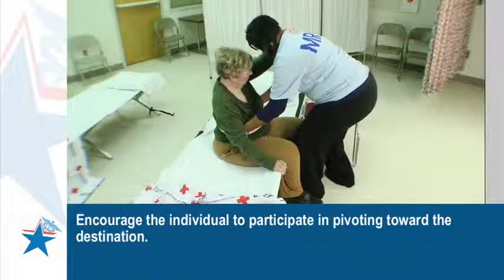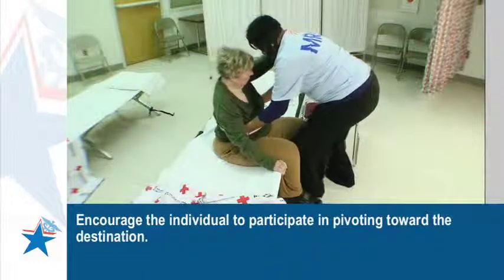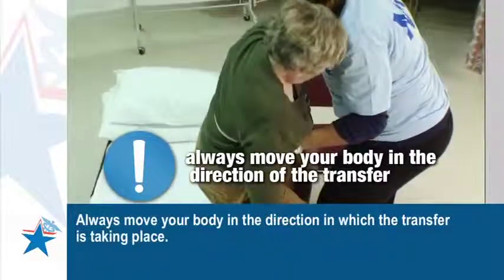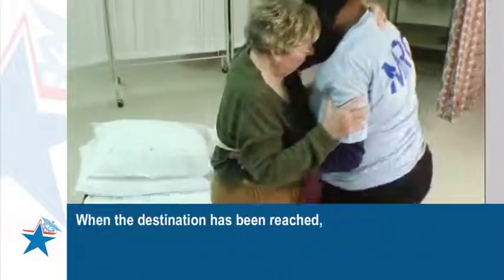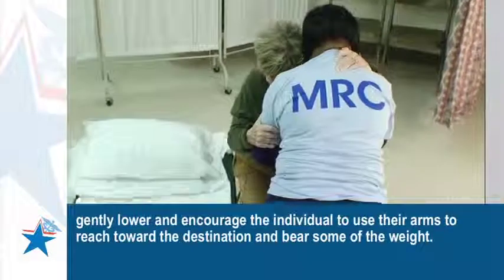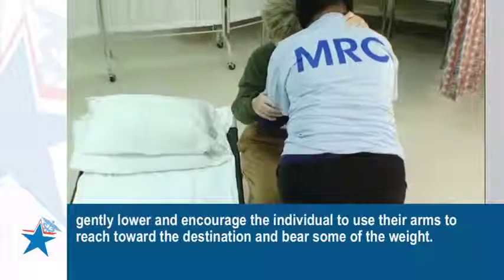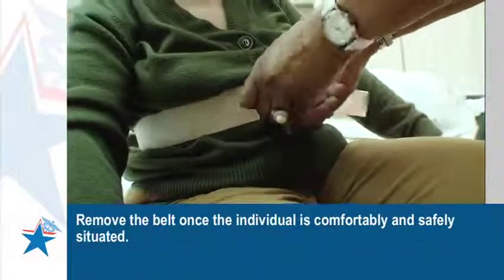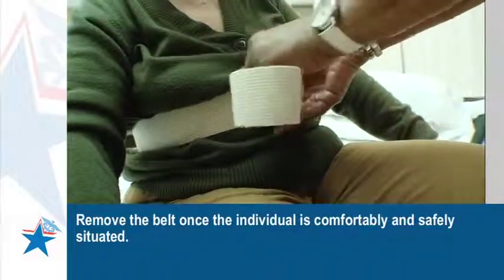Make sure the individual can see the surface to which they are transferring. Encourage the individual to participate in pivoting toward the destination. Always move your body in the direction in which the transfer is taking place. When the destination has been reached, gently lower and encourage the individual to use their arms to reach toward the destination and bear some of the weight. Remove the gait belt once the individual is comfortably and safely situated.